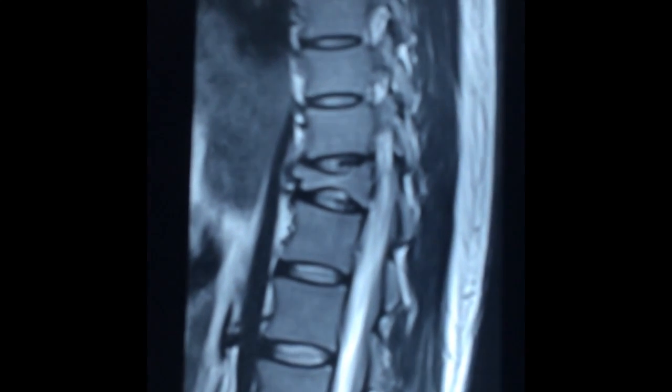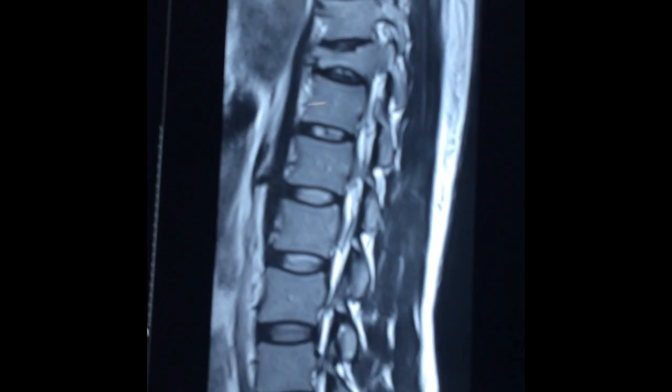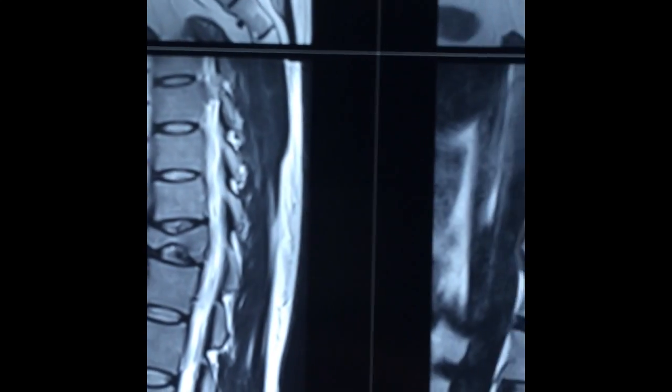This patient had a fracture of the D11 vertebra due to a fall, about a year back.